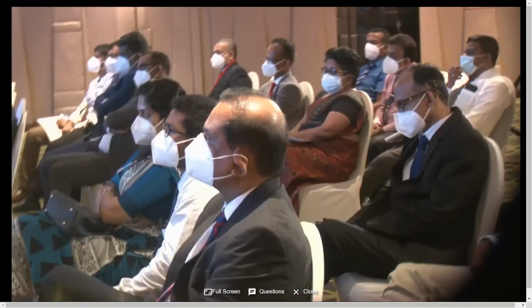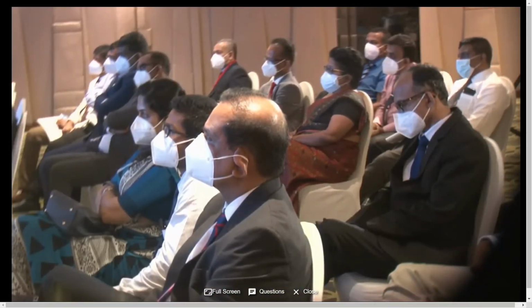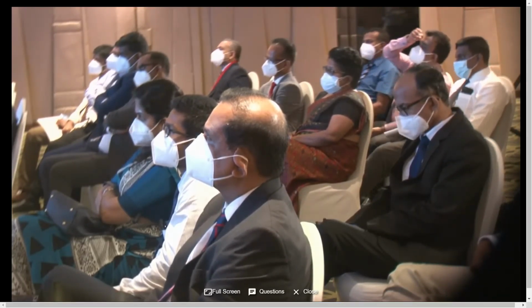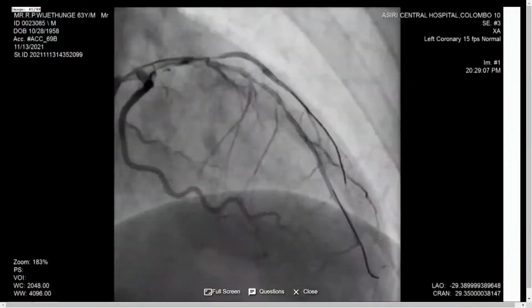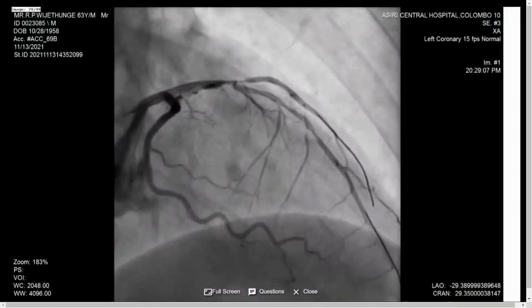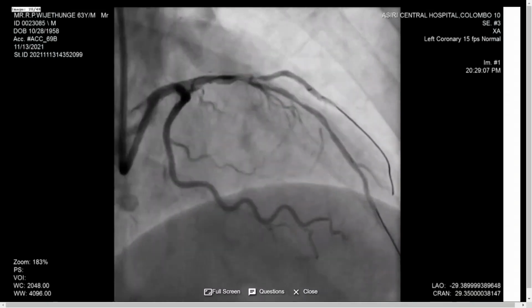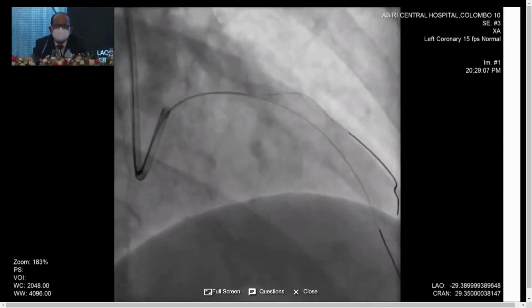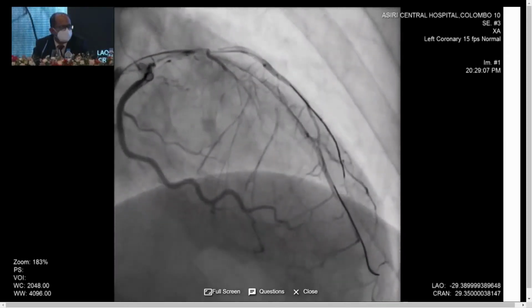Yeah, now Roshan, it's very important because so far we have DK crush 1, DK crush 2, DK crush 3 trials that have come up, and these trials have shown there is a big benefit. But one has to remember that these are very experienced operators, so operator experience and their liking for this technique is very important. If you're going to do DK crush for the first time, it's not going to be easy. If you are starting with this, you probably have to start with a colleague, get experience and then do it.